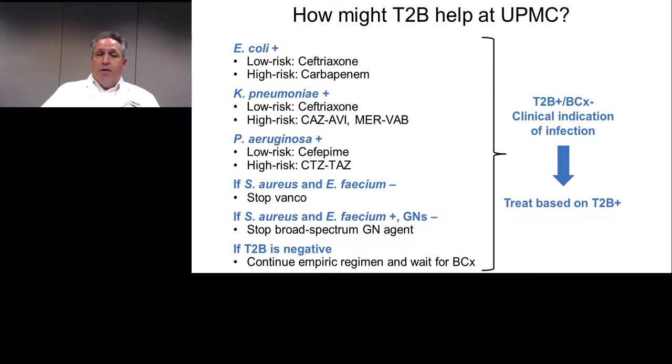On the other hand, particularly among our transplant recipients at UPMC, we have significant rates of ESBLs. And in this setting, if you had that type of patient profile, you could use this early result perhaps to stratify to a carbapenem. And I won't go bug by bug through this, but it shows how you can use your local data and early pathogen identification to guide more rational antimicrobial choices.